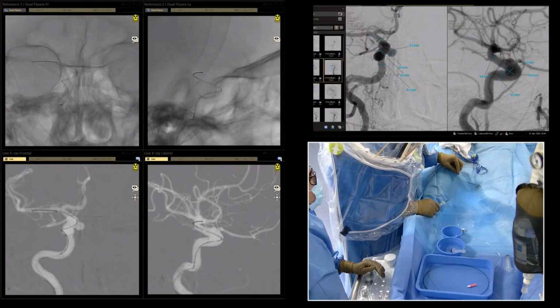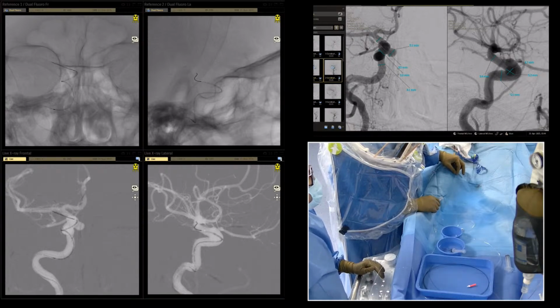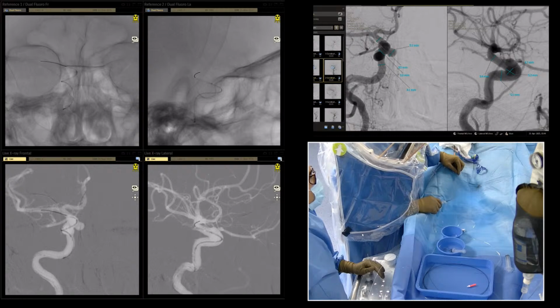It will start to open. There are silicone wings. We need to open nearly a couple of centimeters, and then the stent falls down. Now I think we opened the wings.